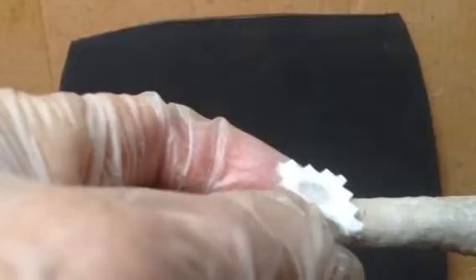Now I'm going to put in one drop of super glue and then the aluminum foil. That will hold that tab down until the super glue sets. You see the aluminum foil is stuck to the super glue, which is stuck to the cellulose, which is stuck to the bone.